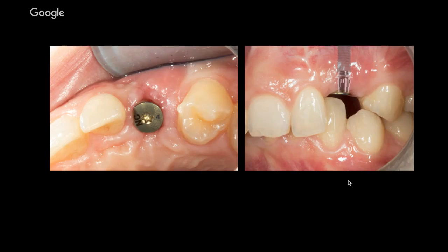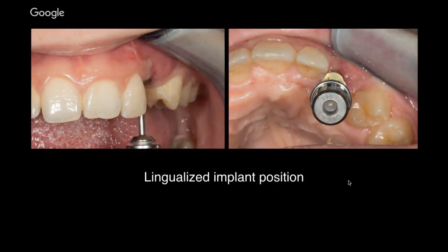And if we put a 3.5 mm titanium base abutment and strip 1 mm from the lower canine and make a modified zirconium crown, everything will be excellent. Additionally, the horizontal position of the implant is also perfect. We didn't discuss it today, but maybe in the future. It's in the cingulum position.